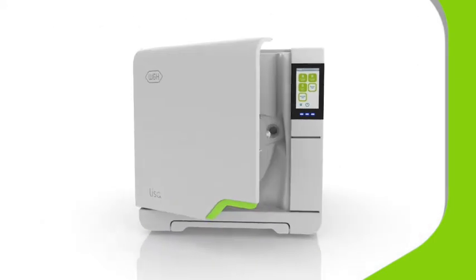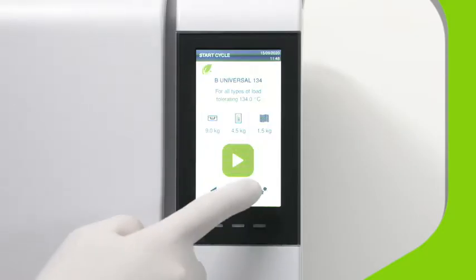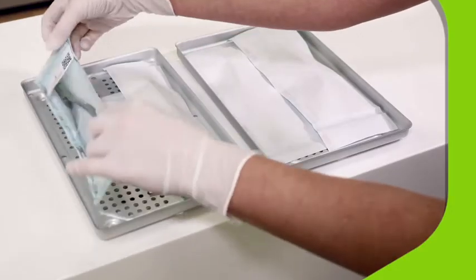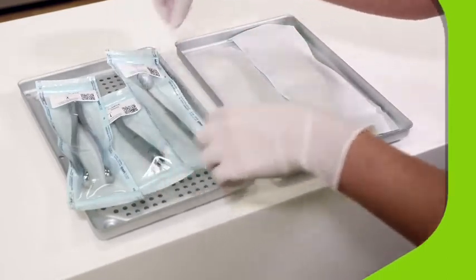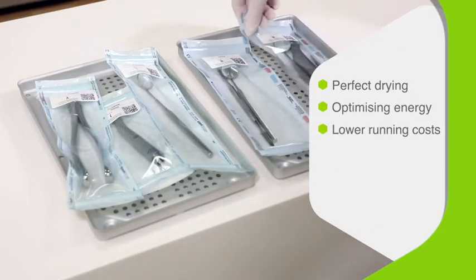To activate EcoDrive Plus, simply choose from three Type B vacuum sterilizing cycles for different compliance requirements and product types. From handpieces to gowns, Lisa will automatically adapt the cycle time to be as short as possible, whilst maintaining perfect drying results, optimizing energy consumption, and lowering running costs.